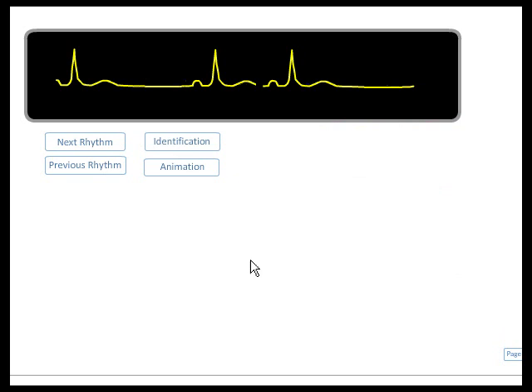In this slide, we have a regular rhythm with a P wave in front of every QRS. The PR interval is constant with normal width, and the QRS is narrow. Now, the rate is about 30 to 35.